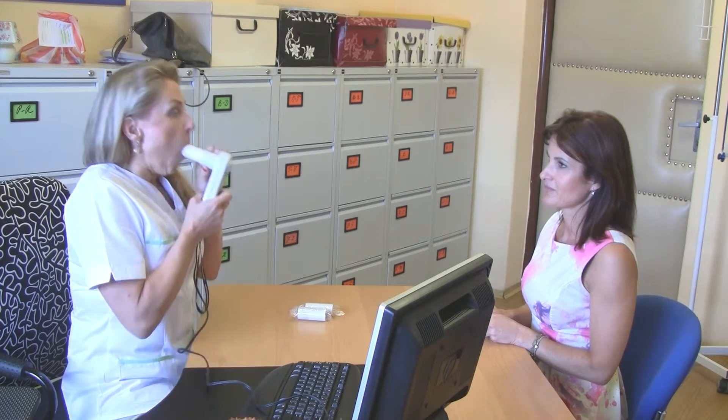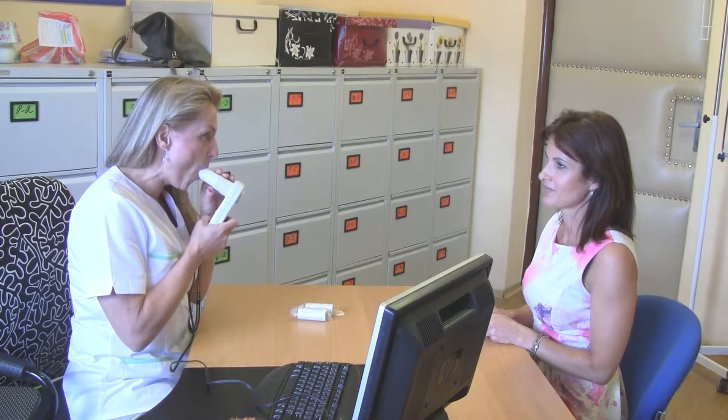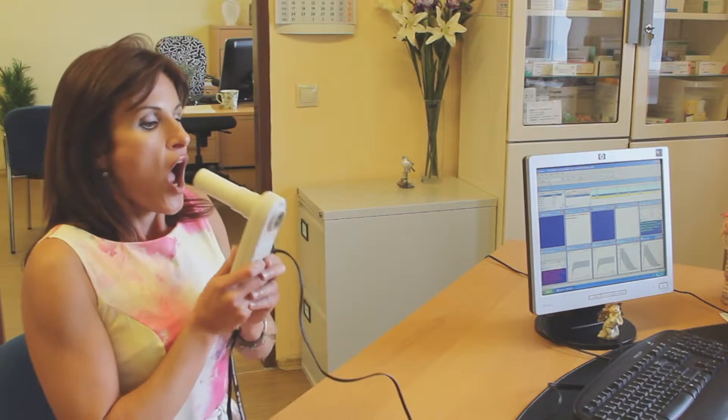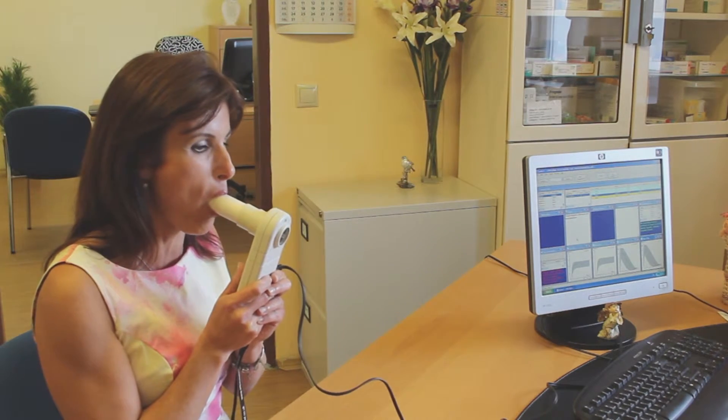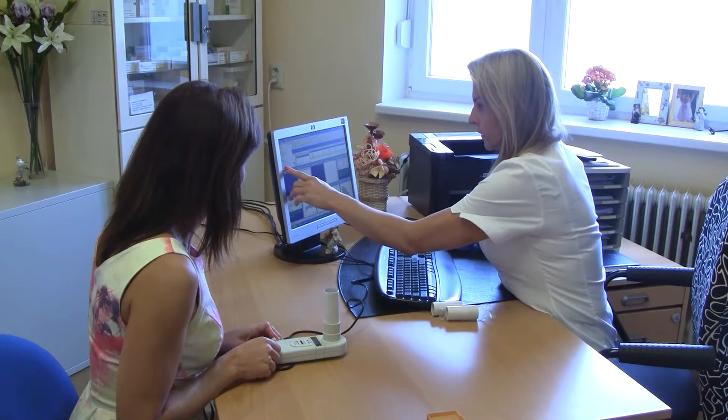First, take a deep breath and blow out through the paper mouthpiece into the spirometer with all your strength — as fast as you can and as long as you can. It is necessary that the patient's lips grip the mouthpiece tightly so that no air escapes. The doctor encourages the patient to exhale into the device as strongly and as long as possible, for at least 5 to 6 seconds.